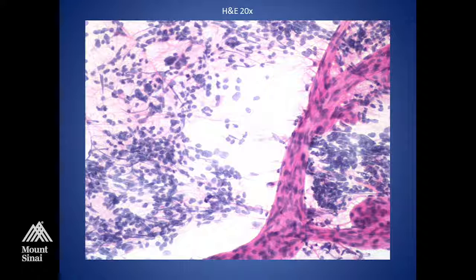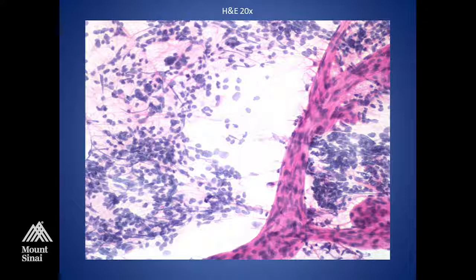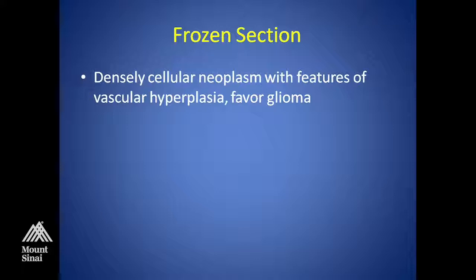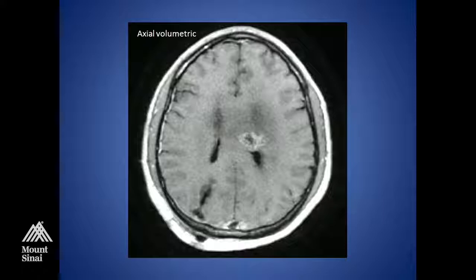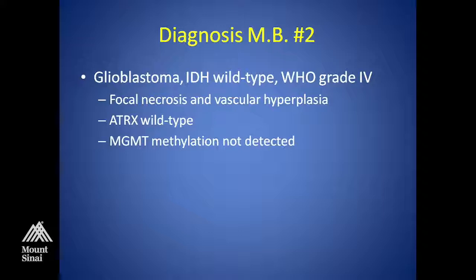If you call it endothelial proliferation or vascular proliferation, this is atypical. On frozen it's not definitive for vascular hyperplasia, but it's a clue. If they think it's a high-grade lesion and I see this, I'll say it's concerning for a high-grade lesion. So this is a densely cellular neoplasm with features of vascular hyperplasia, favor glioma — I would actually say favor glioblastoma in this case. The diagnosis was a glioblastoma: IDH wild type, WHO grade 4, with focal necrosis and vascular hyperplasia on permanent section. ATRX was wild type, and MGMT methylation was not detected.